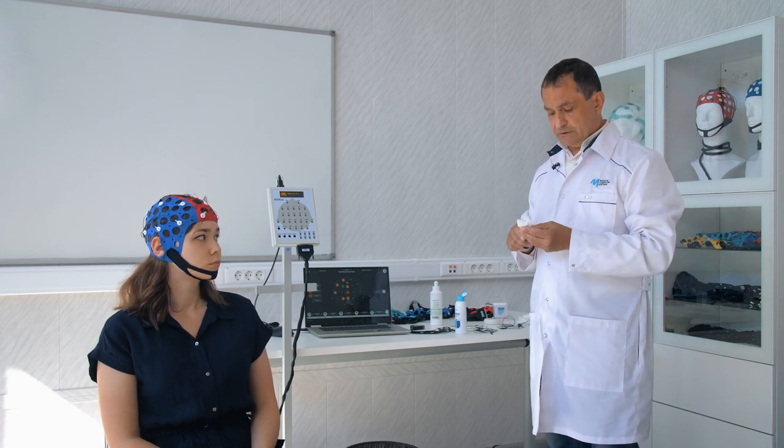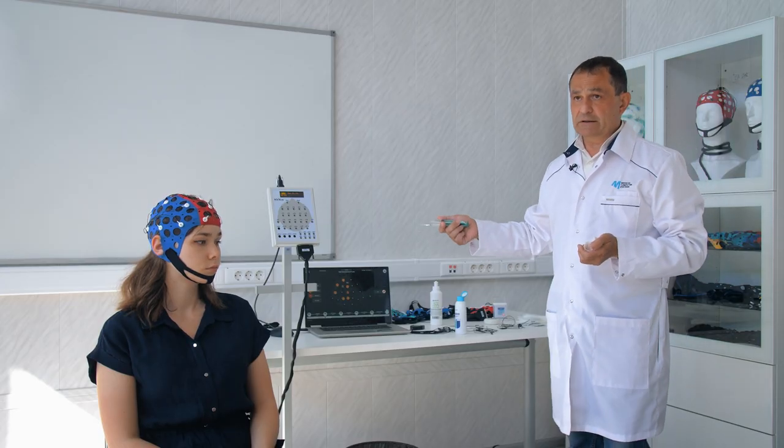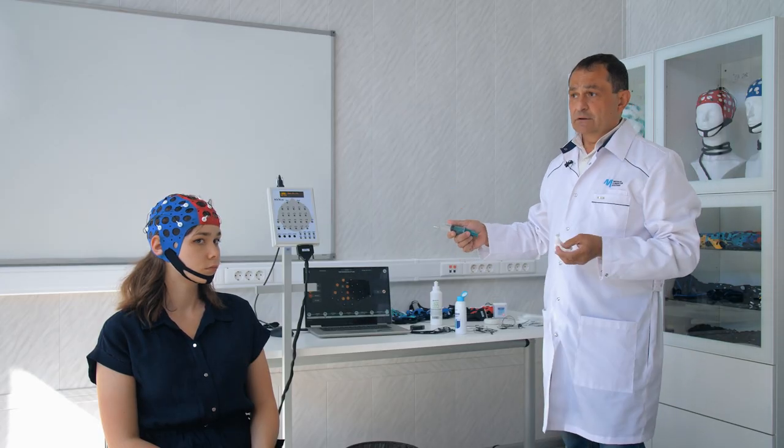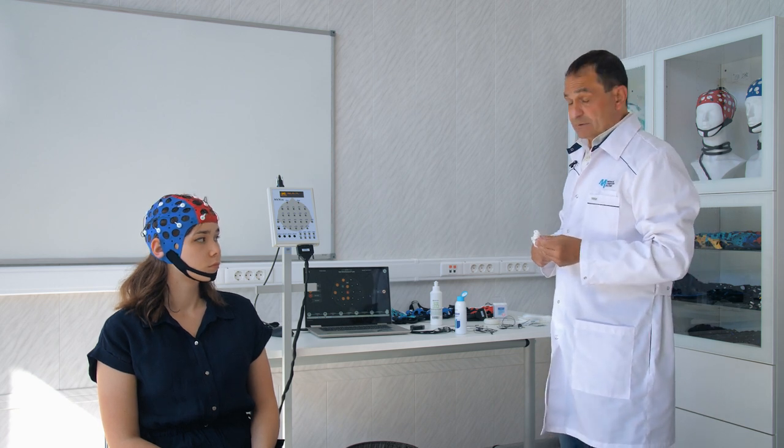In electroencephalography, the required level for EEG registration is considered to be 5 kOhm. We can programmatically set the satisfactory range from 5 to 15 kOhm, and from 15 to 40–45 kOhm. Above 45 kOhm is already a level that does not permit registering an EEG due to the restrictions it imposes. You must achieve the lowest possible inter-electrode impedance.